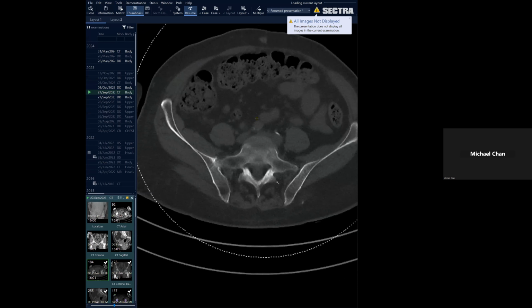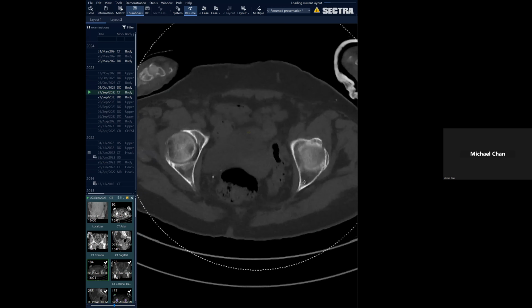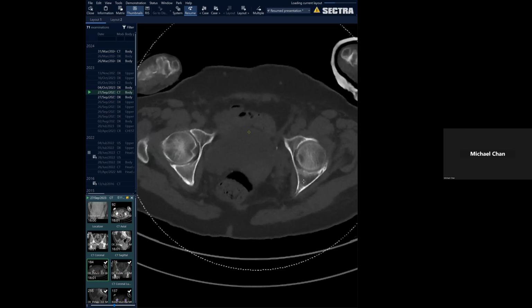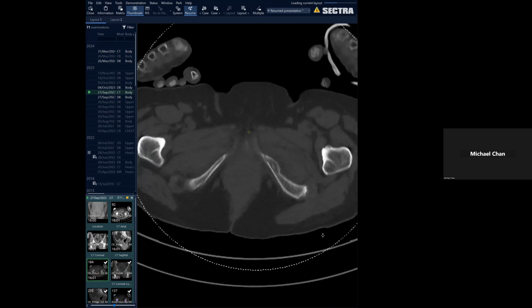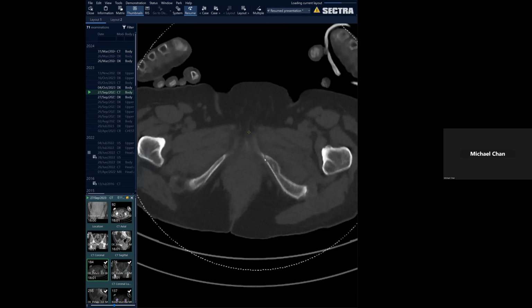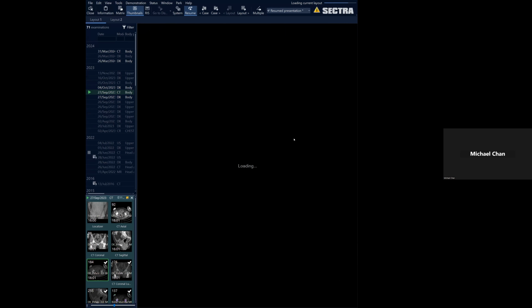And then here's an example of how our bone marrow edema maps can help us. Especially in pelvises, I feel like our pelvic fractures can be quite subtle. So here clearly we have this deformity in the left inferior pubic ramus with an acute fracture line identified. So that's not very difficult to see, but if it will ever load again.